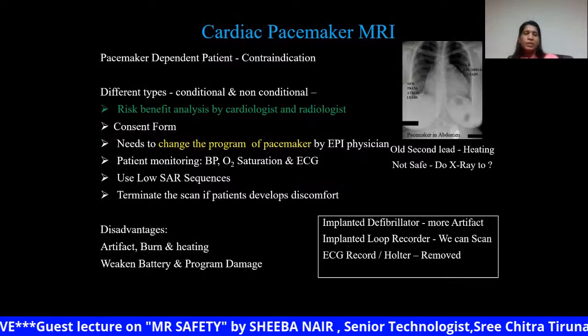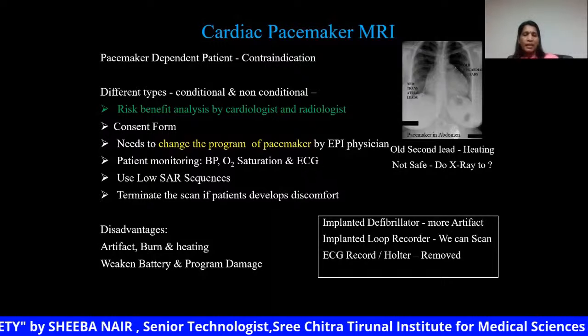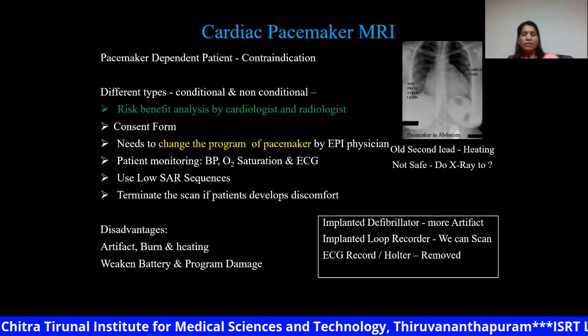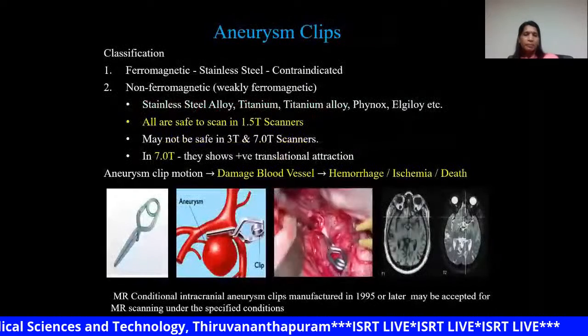And if the patient reports any pain or discomfort, you have to terminate the MR examination immediately, take the patient out immediately, and manage the patient outside the MRI.